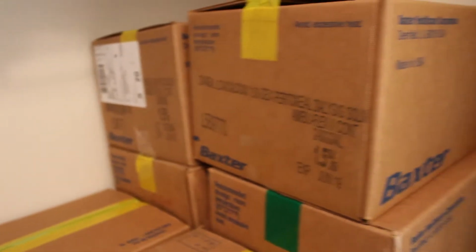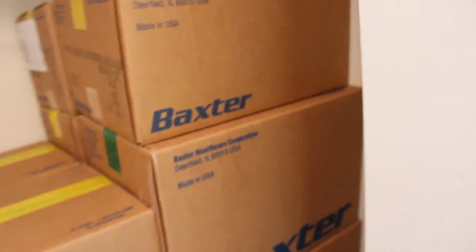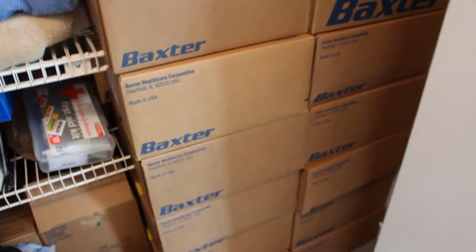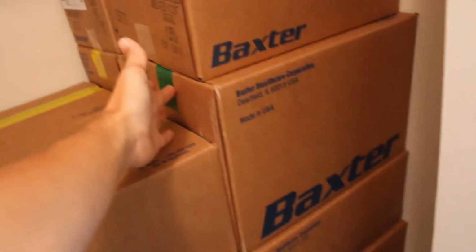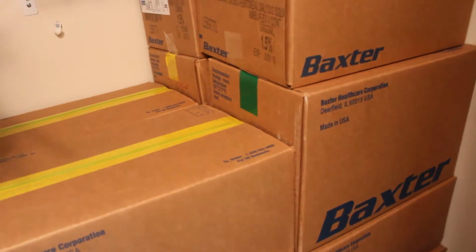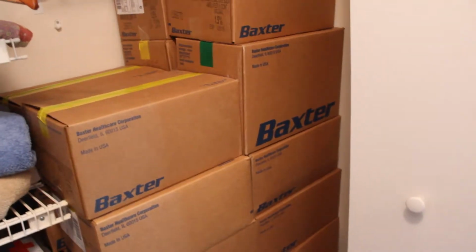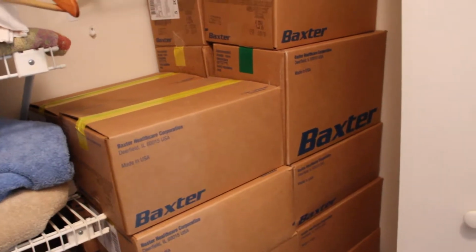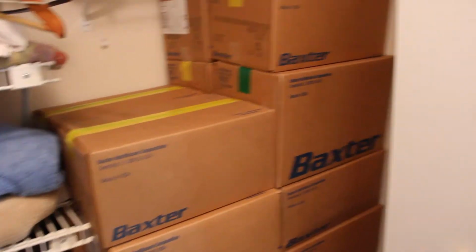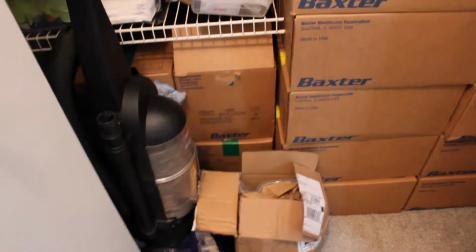And of course I can show you everything on the boxes because nothing on here is actually specific to me. But there's a whole bunch of them in here, and you'll see some of them have this color. They'll be green. Those are 2.5%. So 2.5% or 1.5% dextrose by volume. So that's what that color difference means. So I thought you might think that was interesting.